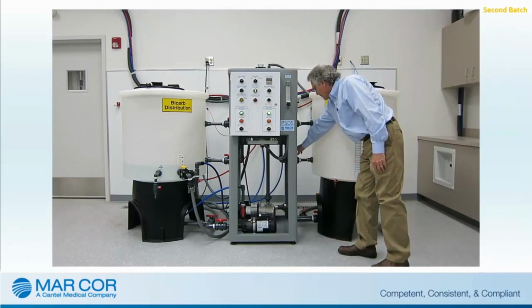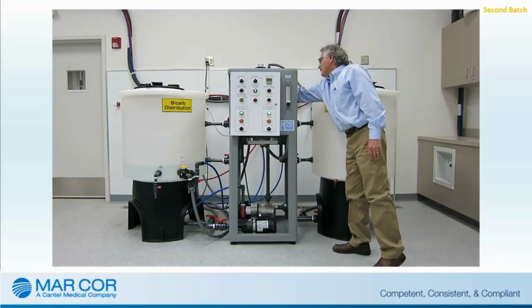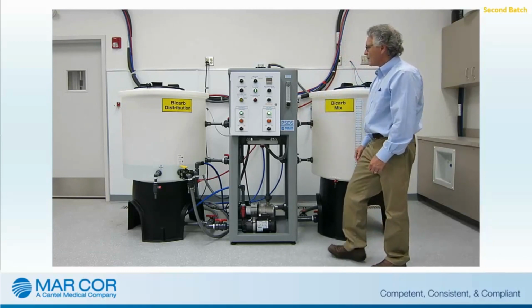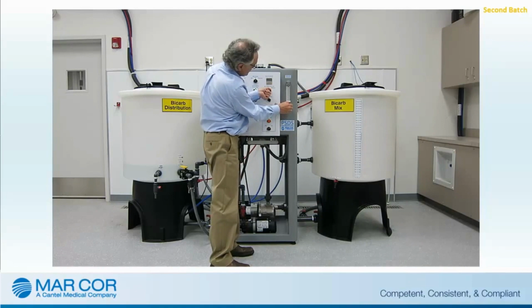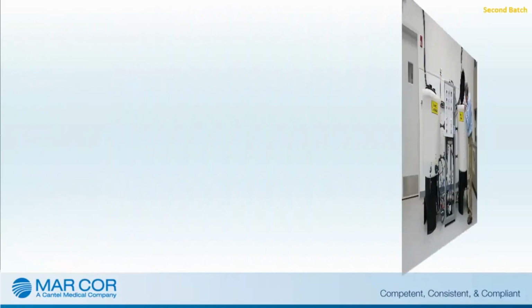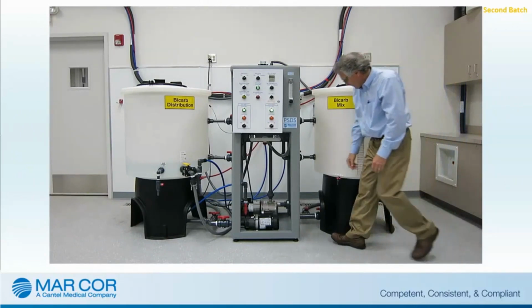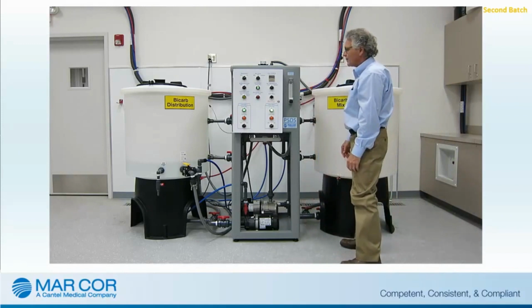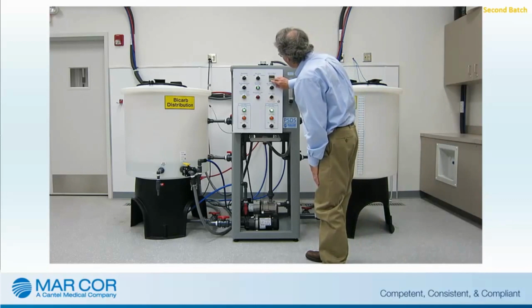The operator will need to determine the amount of water that will be needed for the specific amount of bicarb solution that is being prepared. To perform the mixed tank fill procedure, the operator will need to ensure that the valves are in the correct positions and that the timer has been set for the correct time period to allow water to fill the mixed tank to the correct level needed for the second batch of bicarb concentrate. This will be a similar process to the first batch made.